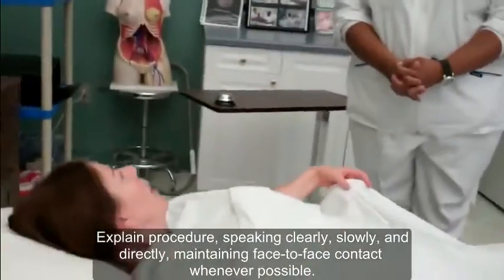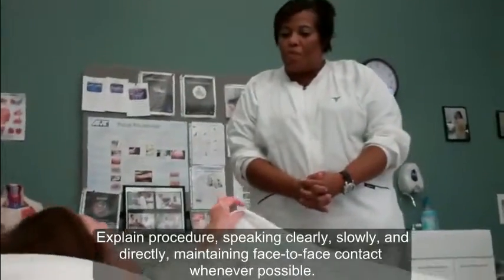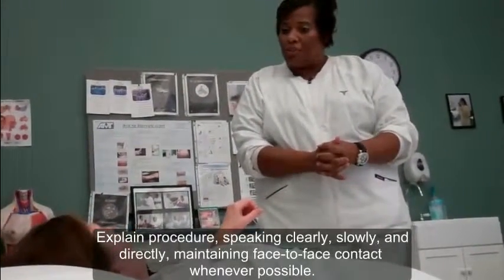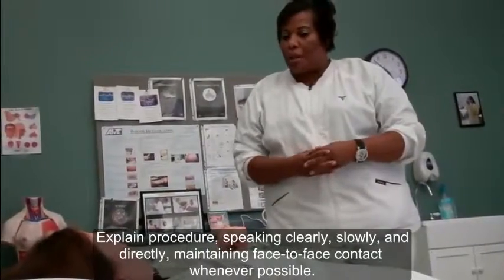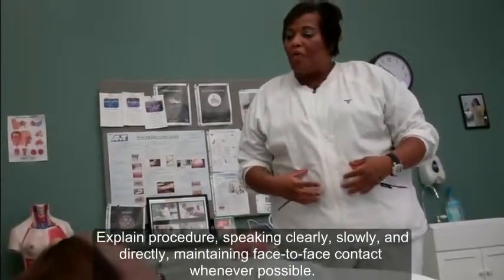Hi, Ms. West. How are you? I'm doing well. Great. I'm going to help you get up out of the bed today and get you from your bed to your wheelchair. We're going to use a little thing called a gait belt that's going to go around your waist. I'm going to put that on over your clothing, okay?